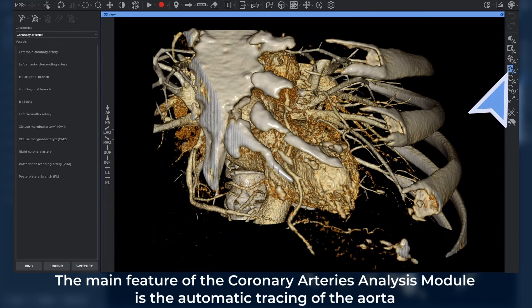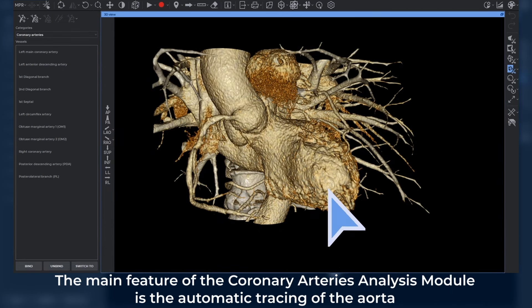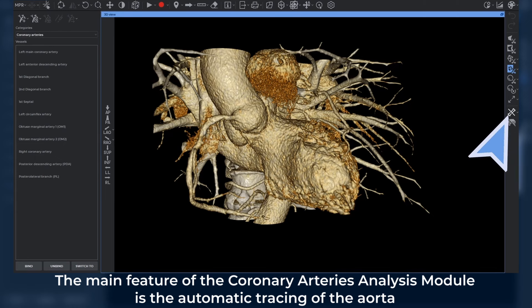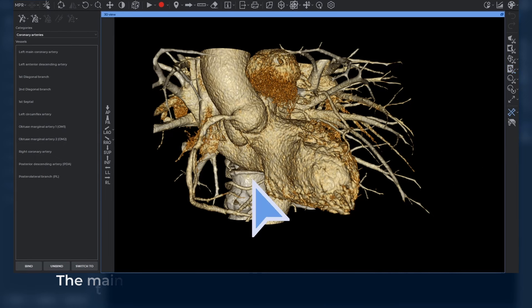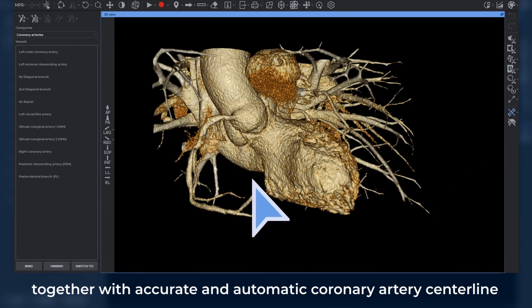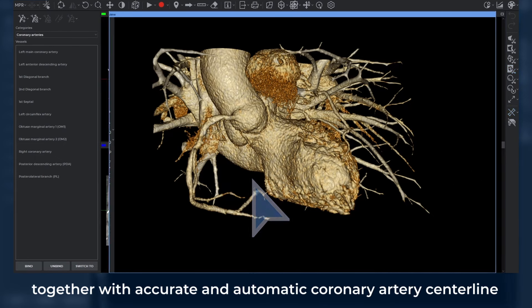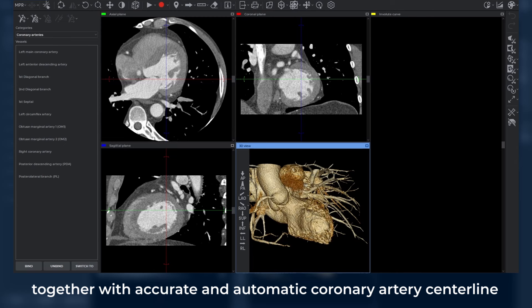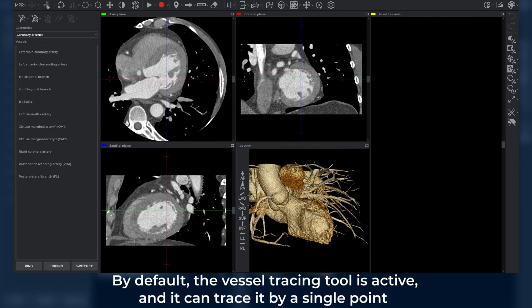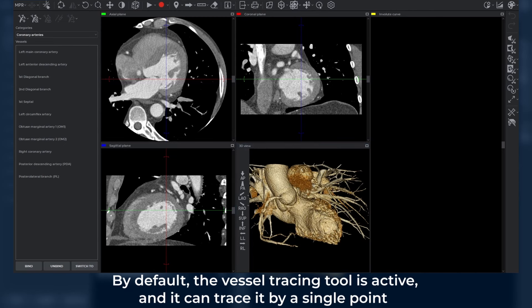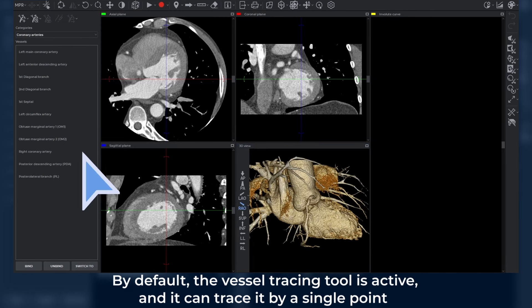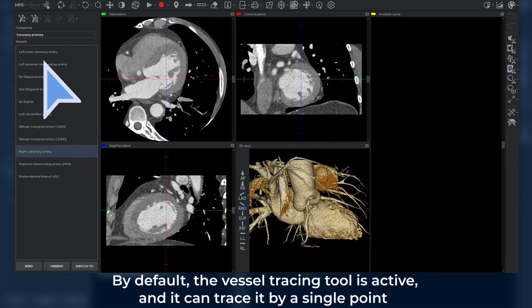The main feature of the coronary arteries analysis module is the automatic tracing of the aorta together with accurate and automatic coronary artery centerline. By default, the vessel tracing tool is active, and it can trace a vessel by a single point.